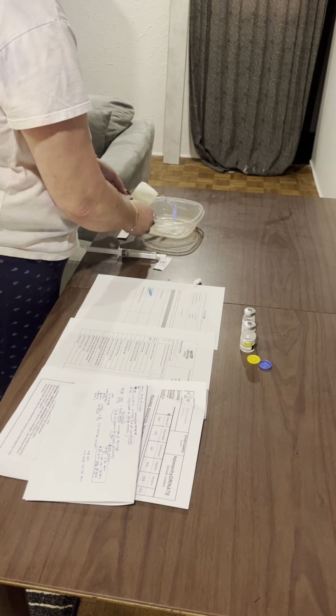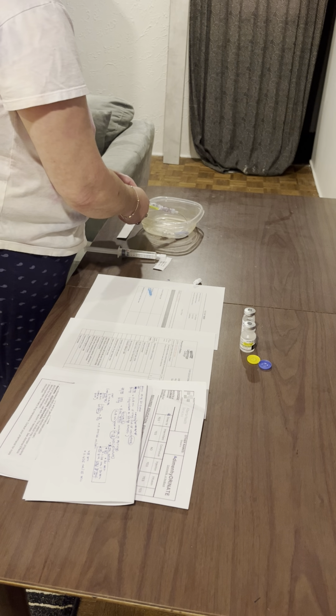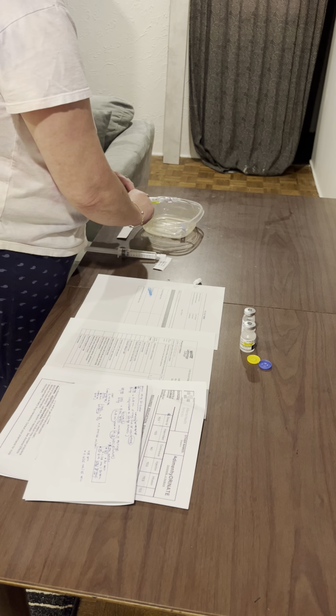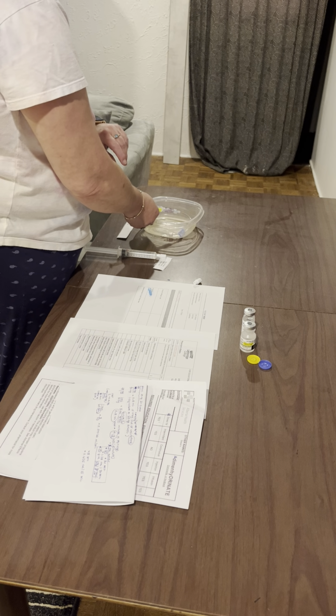Great. Okay. So we can give them the first mil, and so we're going to go from 5 to 4 here. And then we're going to look at our watch and wait 30 seconds.